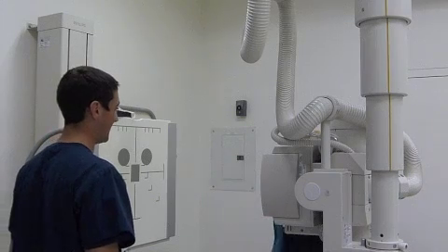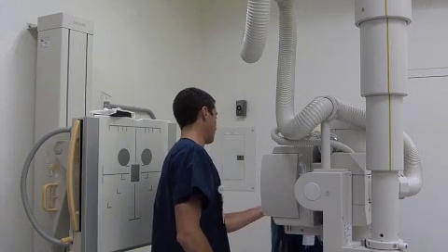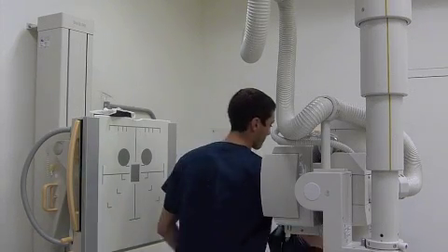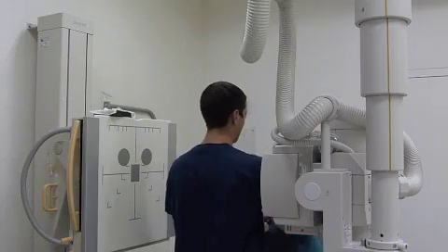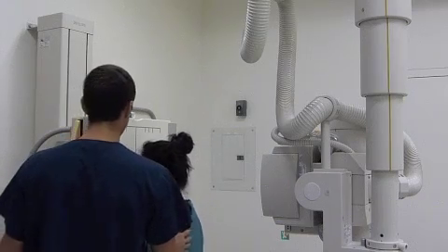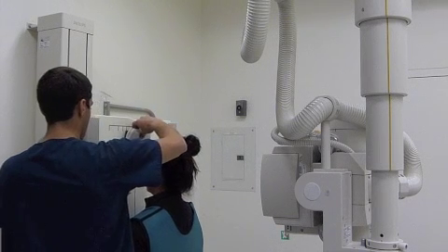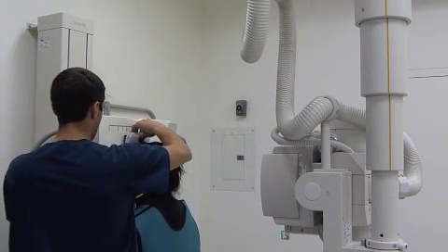Oh, there we go. There we go. Alright, go ahead and put your chest up against this here. We'll put the sponge on your forehead and put your nose against the board.